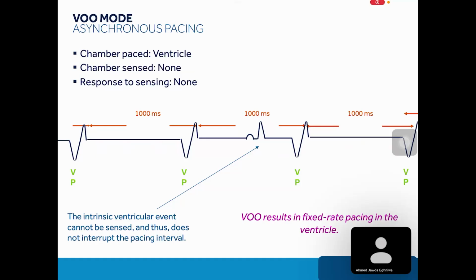When will we use this mode? We use this mode if the patient is going for a procedure with a high incidence of electromagnetic interference, and the patient is pacemaker dependent, like surgery or MRI near the pacemaker. Correct. I will inform the pacemaker not to sense anything. It will pace. Before I activate this mode, I will check for intrinsic rhythm.